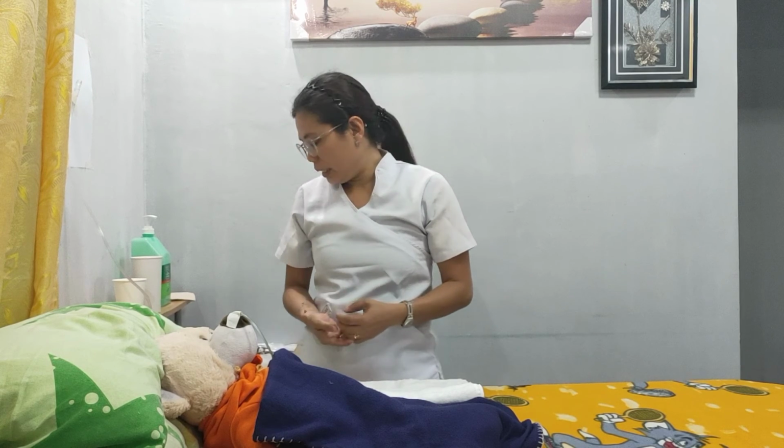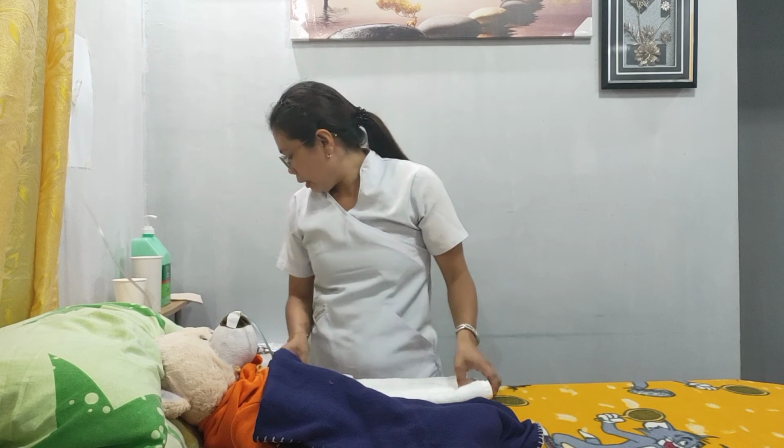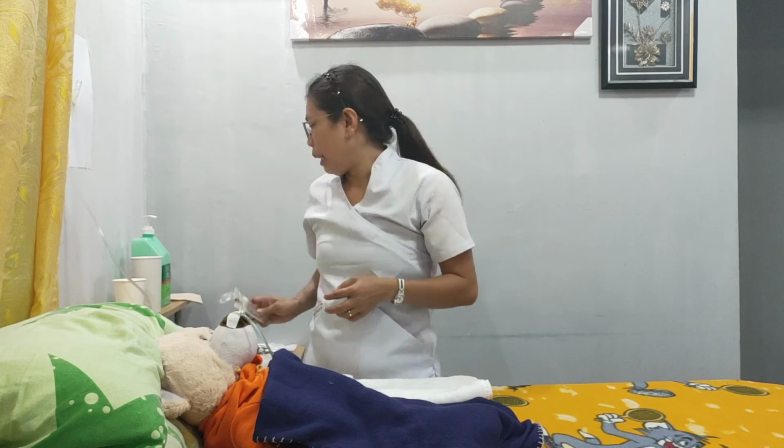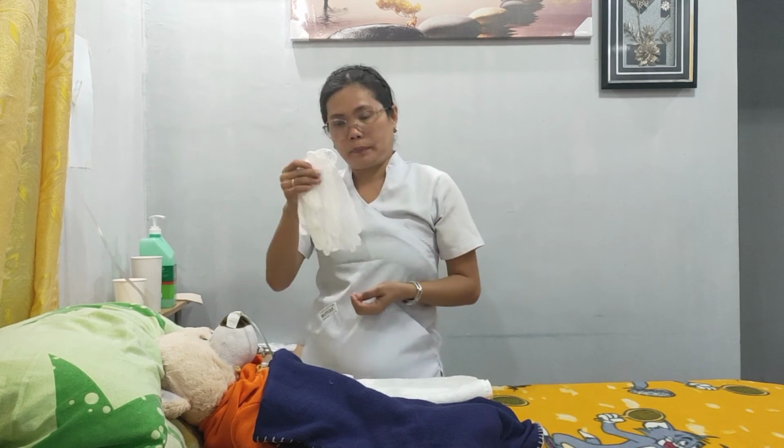When removing the NGT, you must assemble the appropriate equipment such as the kidney basin, tissue, blue pad or towel, syringe, alcohol, and the disposable gloves. Hi ma'am, how are you?